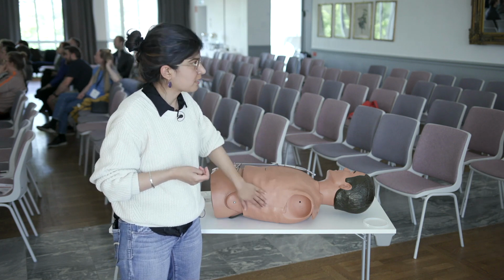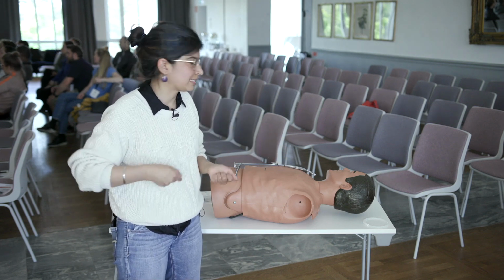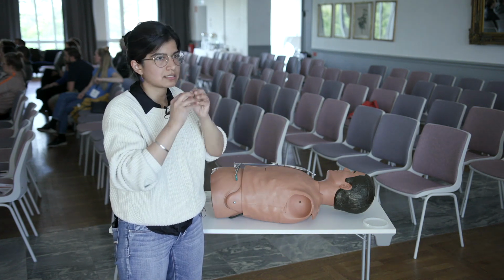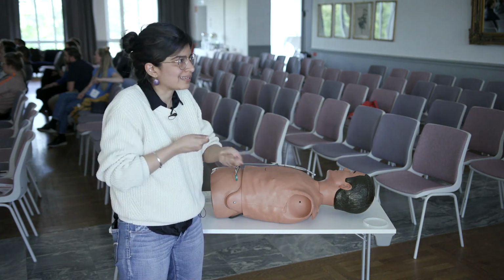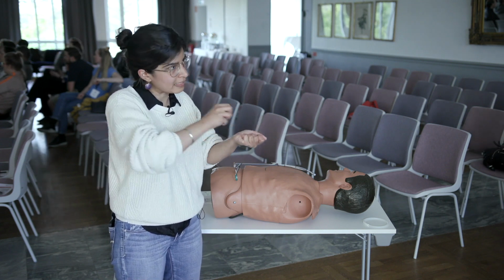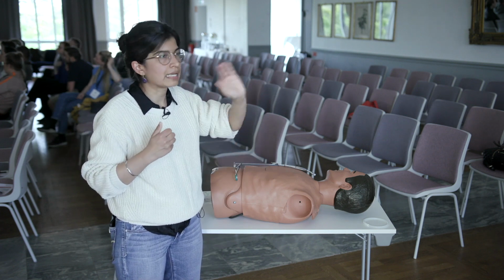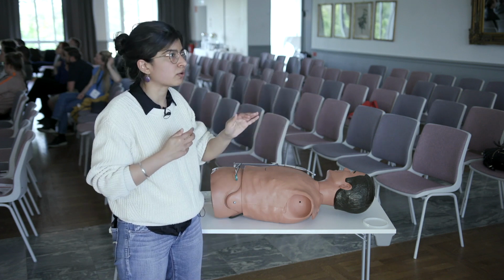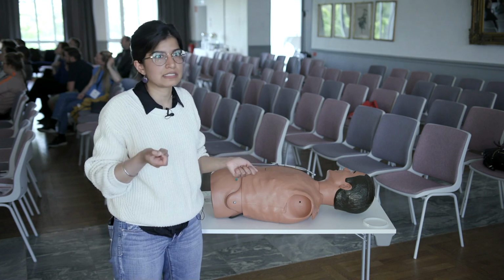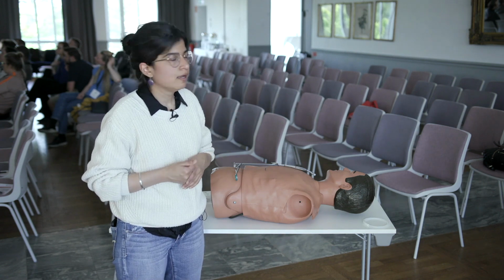So I start off by giving myself a little subcutaneous injection and massage that in. Then I take my needle and go all the way down to the pleura. You feel the pleura because it's a tougher membrane and you can feel a little give. I pop through the pleura on the other side and then inject on the way out. That way you've injected lidocaine into the pleura and around the pleura, and that's my first round. Then with the second 5 cc's, I go to the rib and numb up the periosteal space.